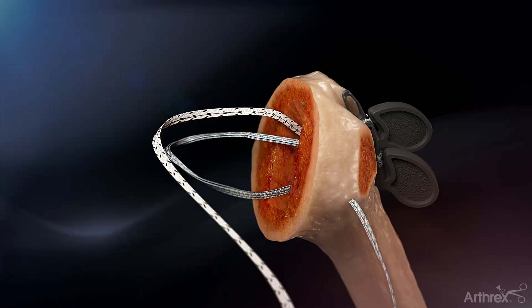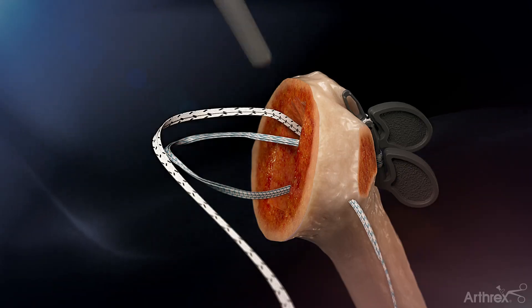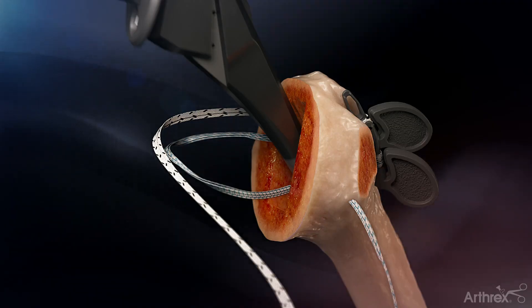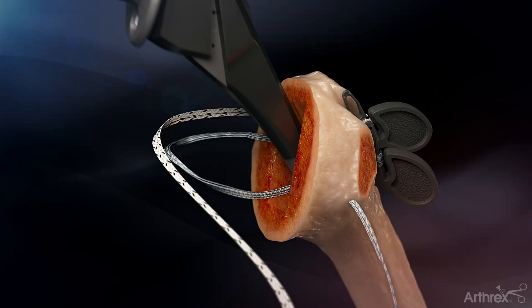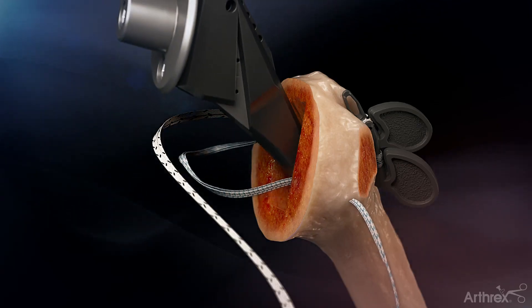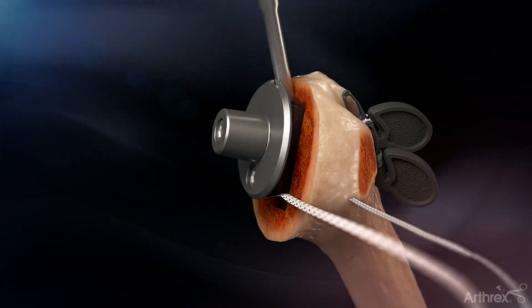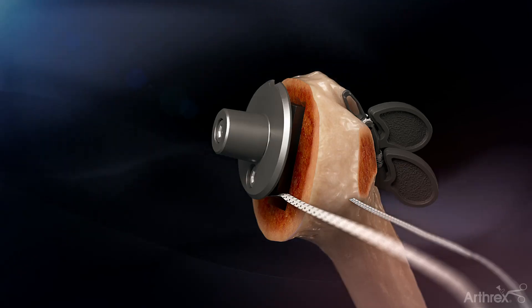These suture limbs will rest on the humeral resection plane and under the stem collar. The distal tip of the humeral stem is then placed inside of the loops created by the fiber tape and tiger tape sutures. Slack is removed from the suture loops by gently pulling on the medial suture strands as the humeral stem is being inserted.